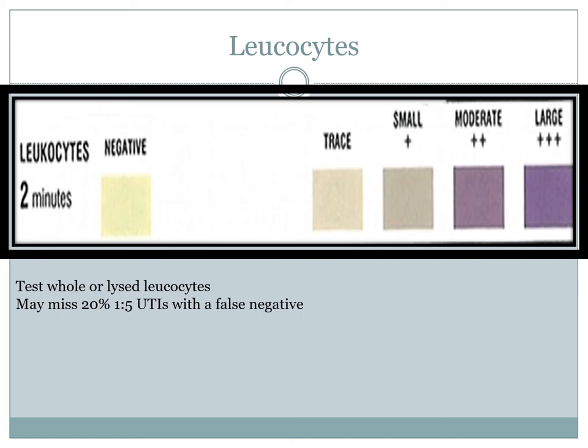False positives and false negatives for leukocytes are more associated with females. A false positive can occur from the mere presence of normal bacterial flora within the vagina, or if the patient is eating foods or taking drugs that give the urine a red appearance — the staining creates a false positive. False negatives are associated with a low bacterial count within a UTI. Women, because of the shortened urethra, generally have a lower amount of bacteria and therefore fewer leukocytes, leading to a false negative. Current antibiotic use and a high specific gravity can also produce a false negative for leukocytes.